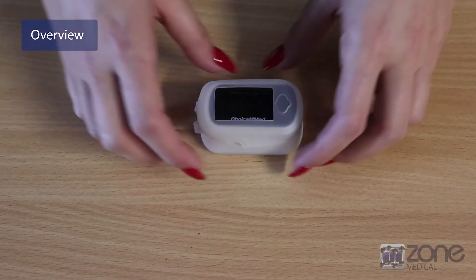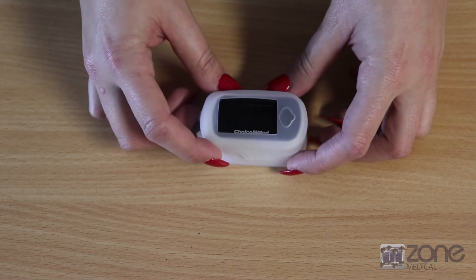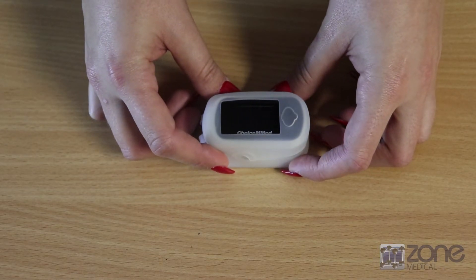This pulse oximeter is very easy to use. It's very good for individual or clinical settings, so you can use it for yourself at home or on patients.